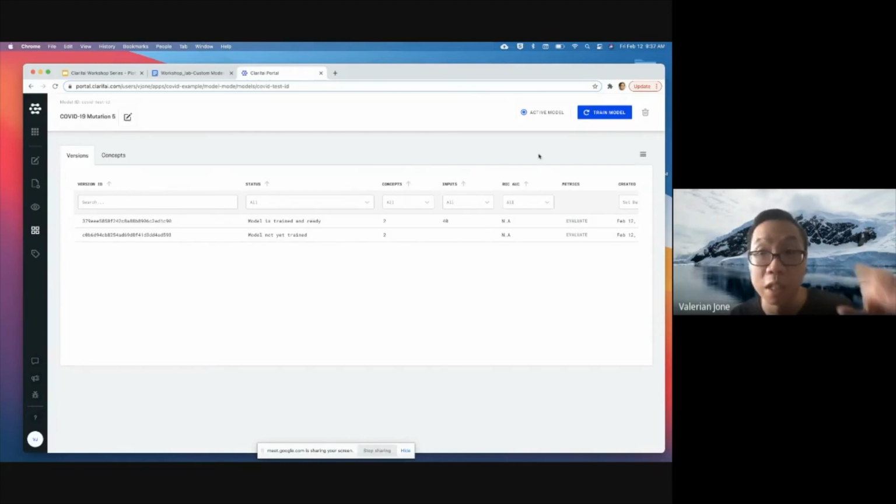Because we're using transfer learning and we can get this model trained so fast, that person can now immediately evaluate and start to test out their model. So going back to the concept of speed and agility, and making sure that we can get things into production quickly, this constant and immediate feedback is one of the benefits of the platform.